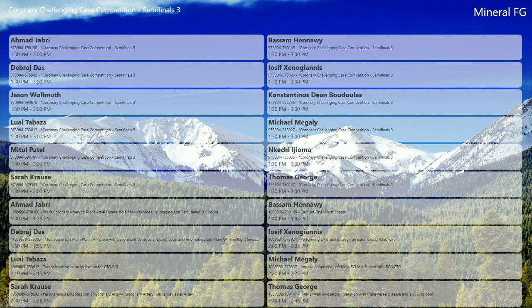Yeah, getting a 16 millimeter vascular plug into a coronary fistula may be challenging, because that probably takes at least an 8 French guide, I'm guessing? Yeah, they put 8 French, yes.